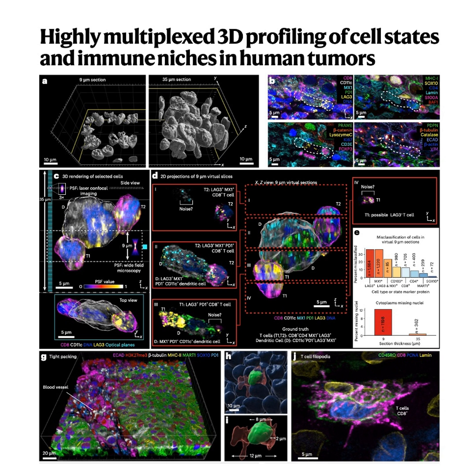Exactly. But crucially, the 3D mapping showed that these interferon-positive inflammatory niches were the precise physical locations where the malignant melanocytic cells were observed crossing the boundary between the epidermis and the dermis, the dermal epidermal junction, or DEJ. And at that exact spot, the invading cancer cells were making contact with immune cells within the niche. So it provides a direct spatial link. The inflammation isn't just general, it's happening right where invasion starts, suggesting a direct interplay that was previously just inferred but now visualized. Precisely, a connection between inflammation and the very first step of invasion, verified spatially in 3D human tissue.